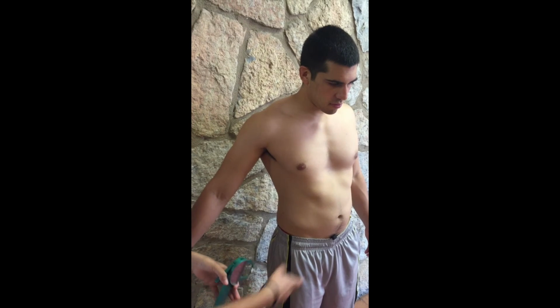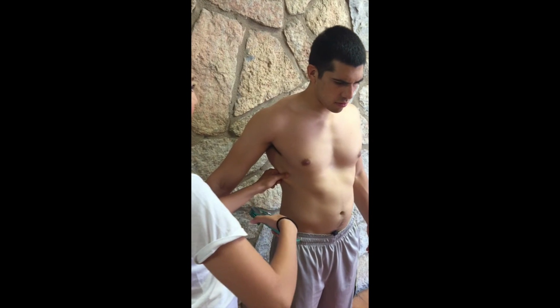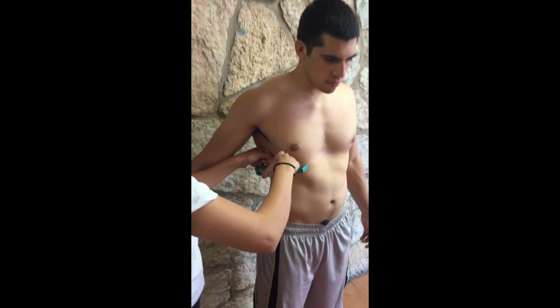The mid-axillary is measured using a vertical fold on the mid-axillary line at the same level as the xiphoid process of the sternum.